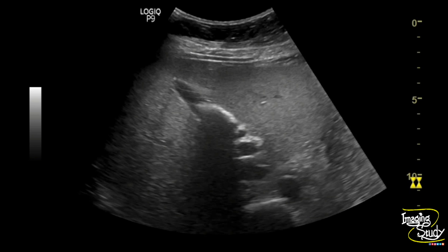Before jumping into the case video, look at this picture. This is the gallbladder — if I show you this picture, what will be your diagnosis? You would say this is a semilunar hyperechoic structure casting a post-acoustic shadow. Definitely this looks like a gallstone, but look here very carefully. This is the margin of the gallbladder, and if you check carefully, this hyperechoic structure crosses the boundary of the gallbladder. That should hint to you that this lesion may not be within the gallbladder.